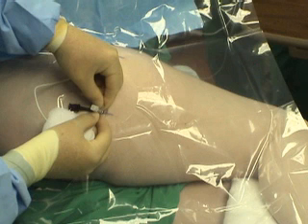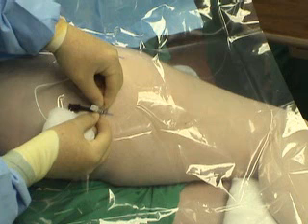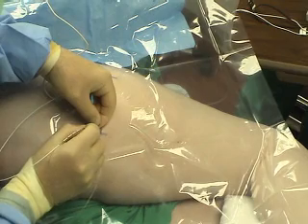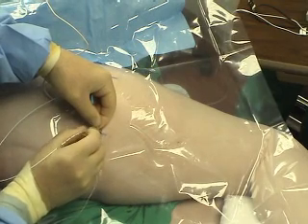Do not inject normal saline or any other conducting fluid through the needle at this stage. The notion of opening up the space with normal saline to advance the catheter is not based on scientific fact, since in live tissue it only infiltrates the tissue, makes it edematous, and makes further nerve stimulation through the catheter impossible or difficult. The proximal end of the stimulating catheter is now attached to the nerve stimulator.